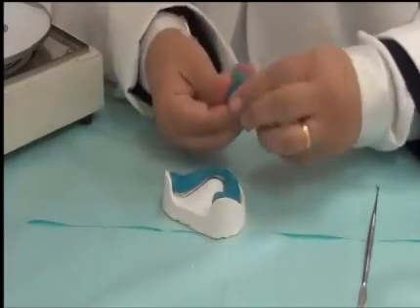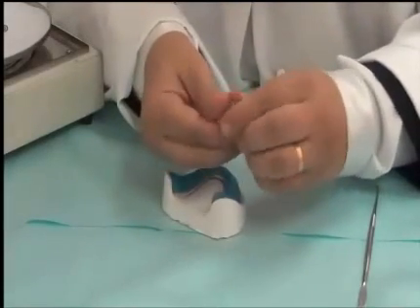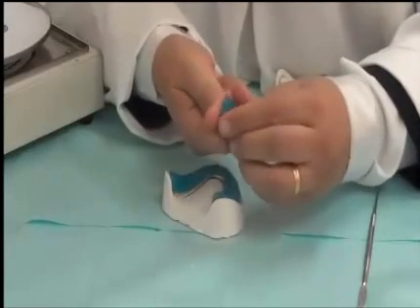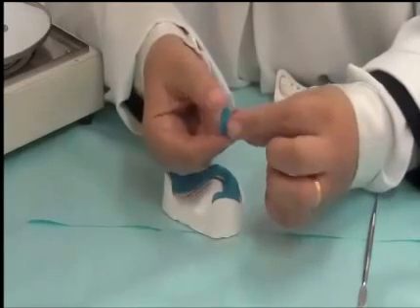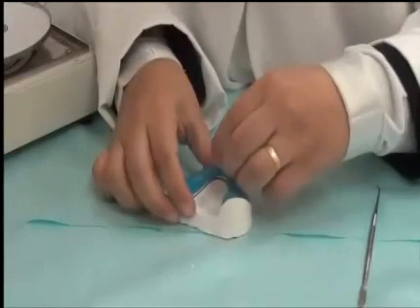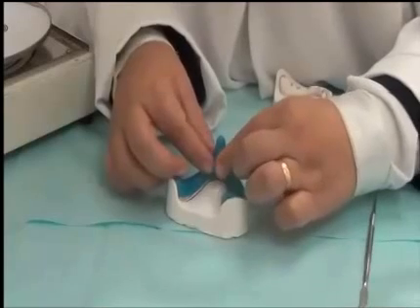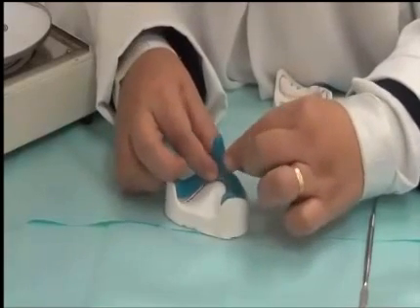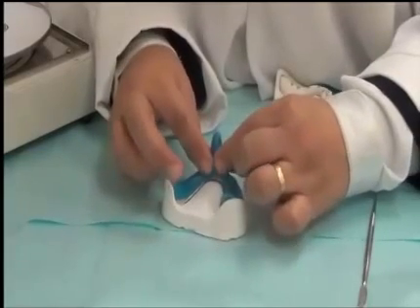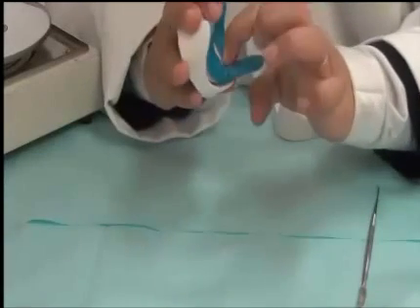So we formulate the handle. Once more, we form it in a roll shape first. Then we press our thumb and begin rotating it against our thumb. This will widen at the base area and thin the outer area. In the base we place a groove, and this groove can adapt to the cast. In the case of the lower, the tray itself is thin in the interior margin area. So we need to make sure that the handle is not bulky over this area. Once more, we adapt it well to the tray.